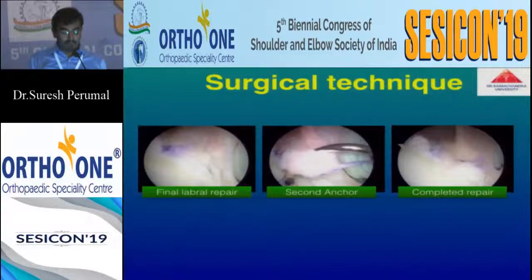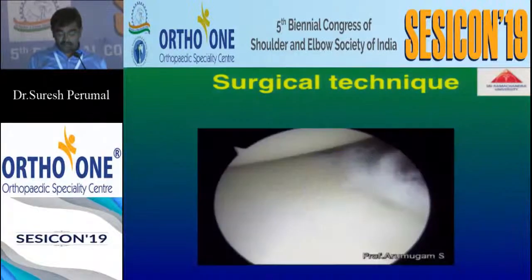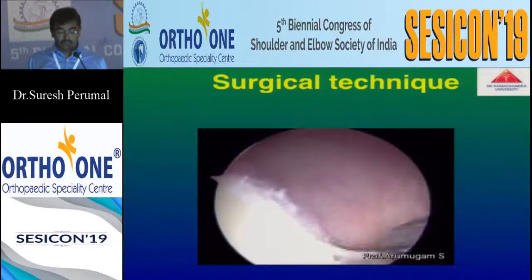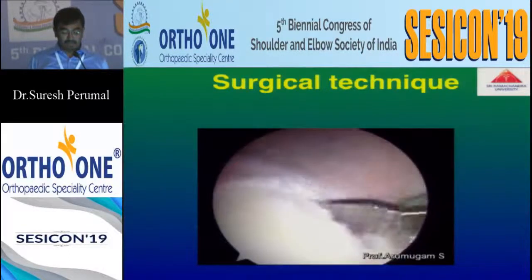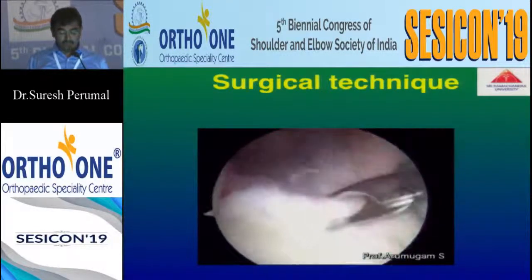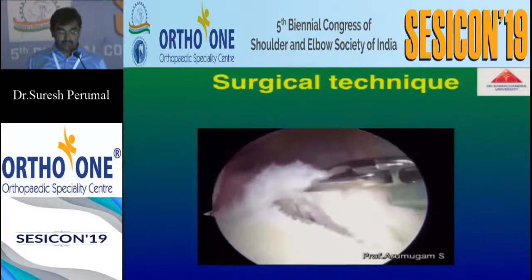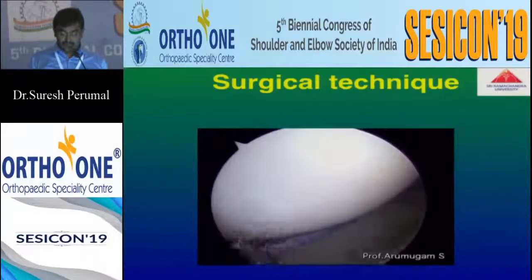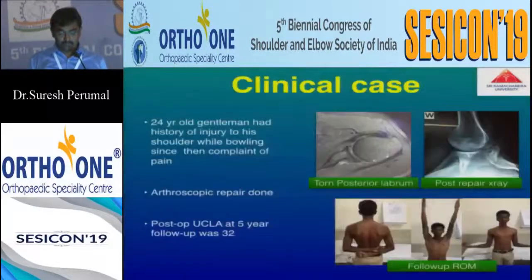Then the final labral repair, and if a second anchor is used, the repair is completed. This is a surgical picture where the tear is identified and elevated, and rasping is done, followed by reduction, after which we place the anchors and then the labral repair is done. It's one of the few clinical cases.